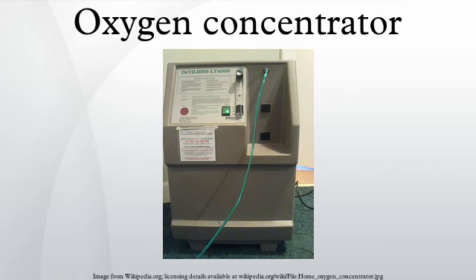Temperamental units are worthless to the medical community, since an individual's health frequently relies on the constant extended operation of the unit. However, such units are valuable to metal and glasswork hobbyists. Because oxygen is a permanent gas, it is expensive to obtain in bottled form.